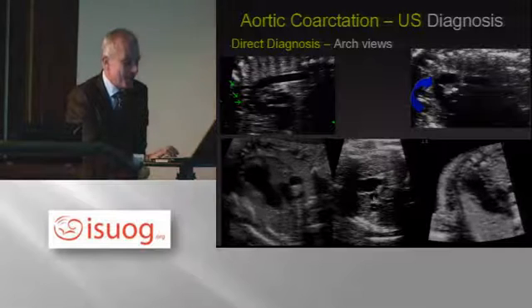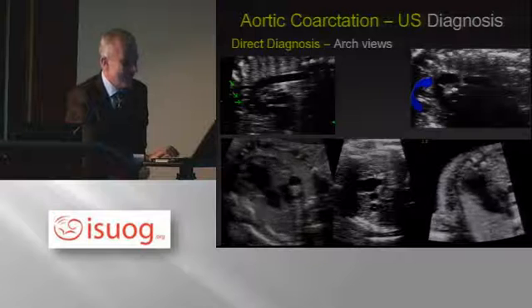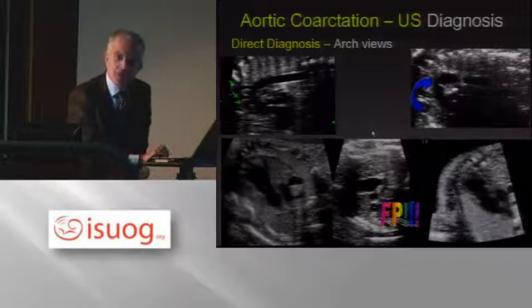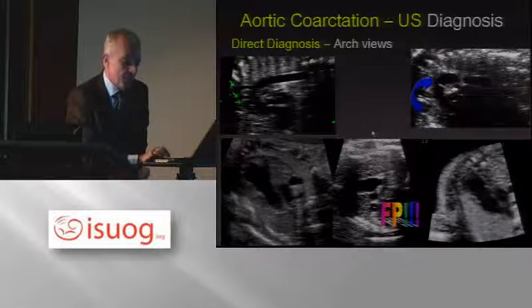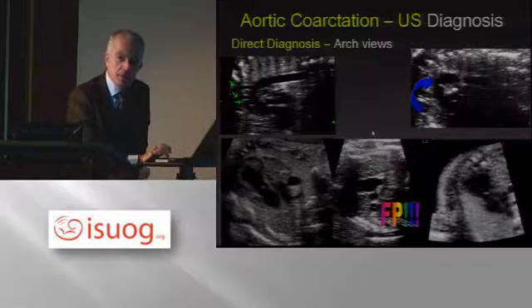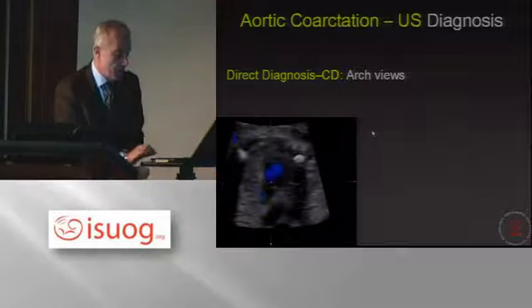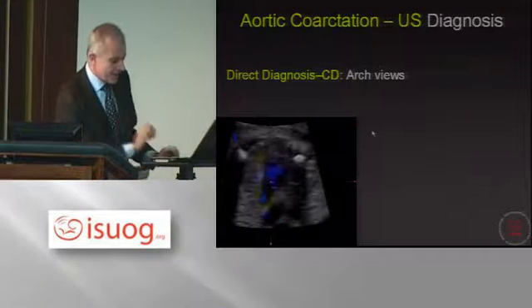Of the ductal arch over the aorta. It's a pity that in this case this was a false positive and there was no coarctation whatsoever at birth. And so we should keep this in mind when we counsel the patient with the suspicion of aortic coarctation. Color Doppler.